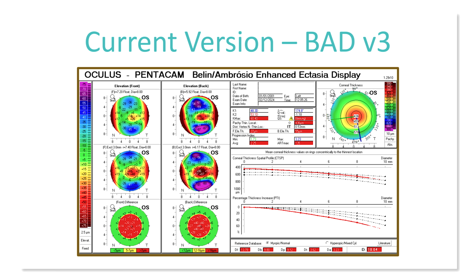That 3 to 4 millimeter exclusion zone is proprietary to the BAD. So you'll see a lot of companies, and I'll address this later, will try to mimic the display, but they use a fixed exclusion zone, which won't give you the same results. The display on the bottom, and I hate saying it's a map, it's the numerical difference going from the standard display to the enhanced display. And that is highly specific for separating normal to abnormal, or in this case, normal to ectatic disease.